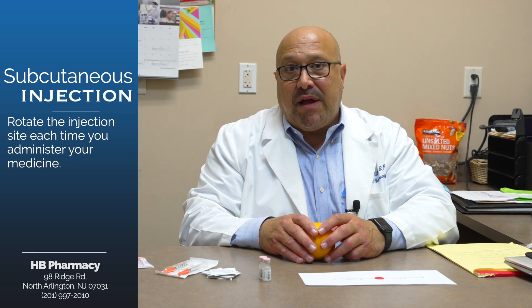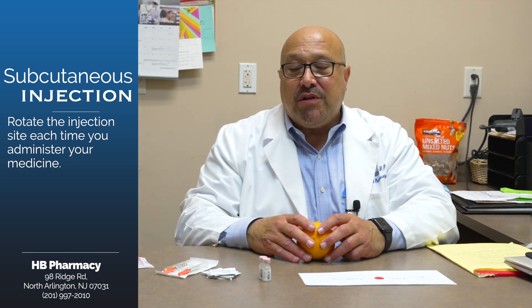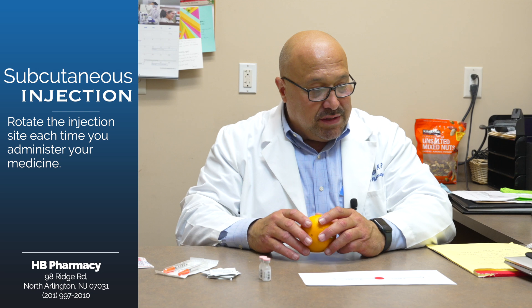It's important whenever you're doing these types of injections to rotate the sites. For example, a semaglutide injection, which is given once a week, you rotate the site every week to a different spot. Eventually you can make your way back to one that you started, but it's very important to rotate the sites.